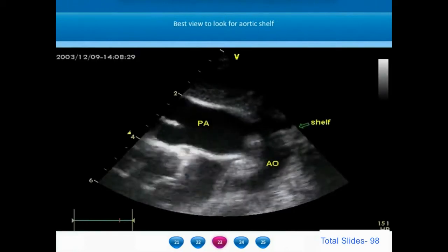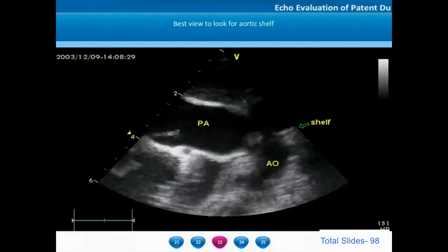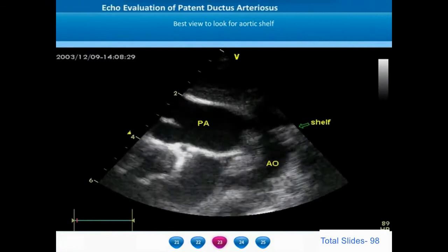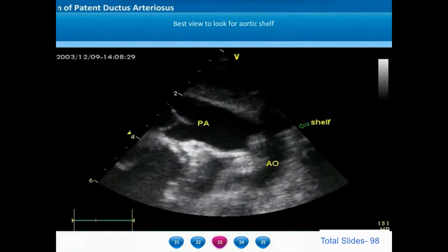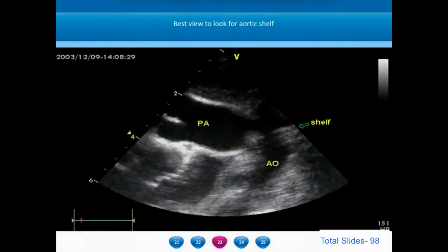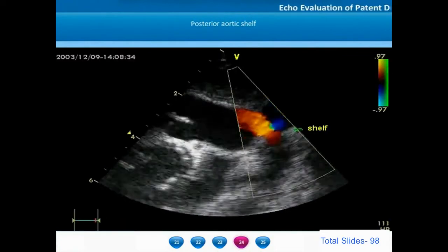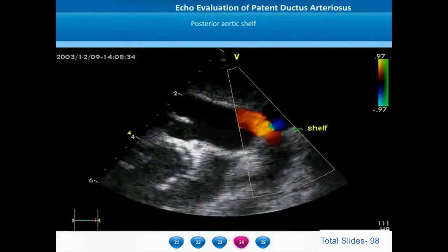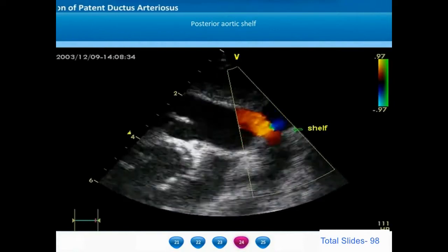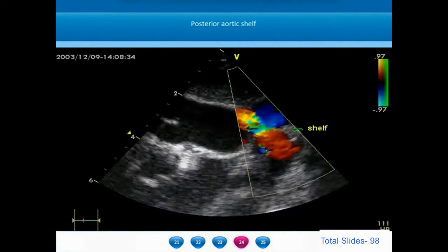In the example shown, there is a posterior aortic shelf. We identify the dilated main pulmonary artery, the descending thoracic aorta, and the ductus arteriosus. Exactly opposite to the ductus on the posterior wall of the descending thoracic aorta, there is a deep posterior aortic shelf — a strong substrate for coarctation. We can see the flow of ductus arteriosus is laminar, indicating that pressures in the pulmonary artery and aorta are more or less similar. We can also appreciate the deep posterior aortic shelf.